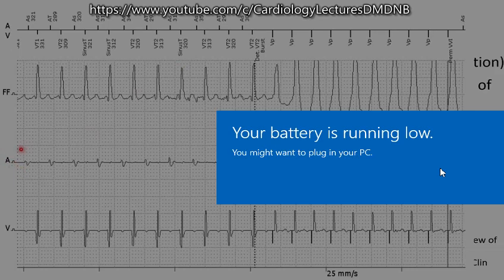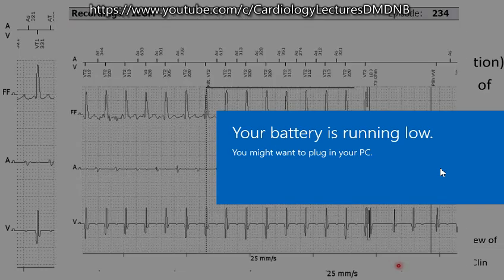And if you see, there is an atrial channel, there is a ventricular channel, this is a far field channel, and you can see it's AV, AV, AV, AV. This is a sinus tachycardia. Despite a dual chamber ICD, the device has diagnosed it as it has gone to a VT2 zone because they had kept this rate as a VT2 zone. It has given a therapy, ATP first, tried overdrive pacing and then shock. That's why he was getting repeated shocks.